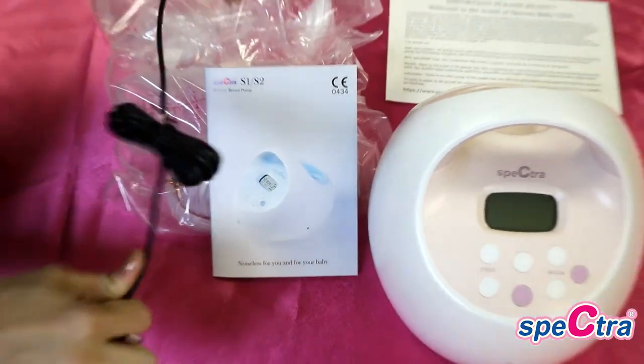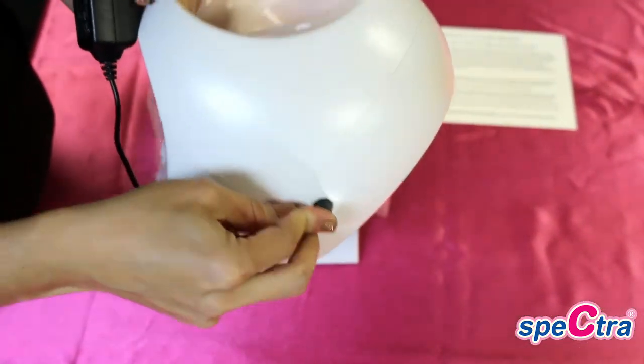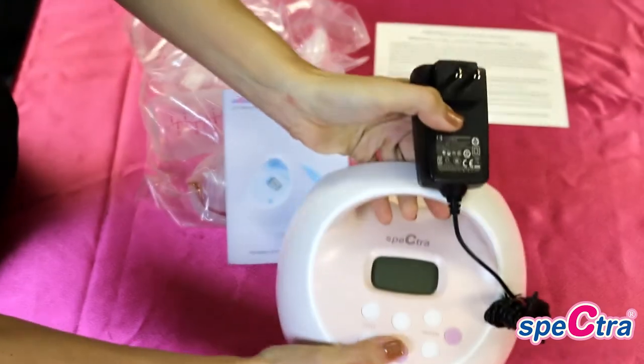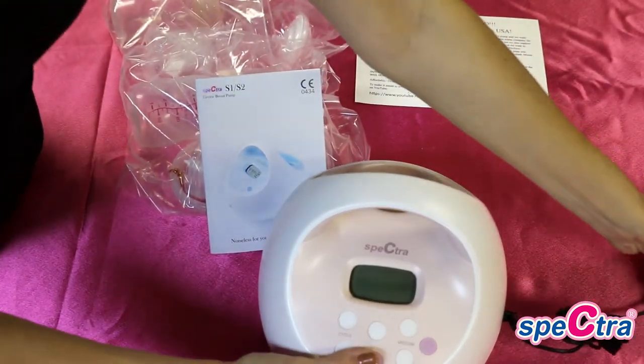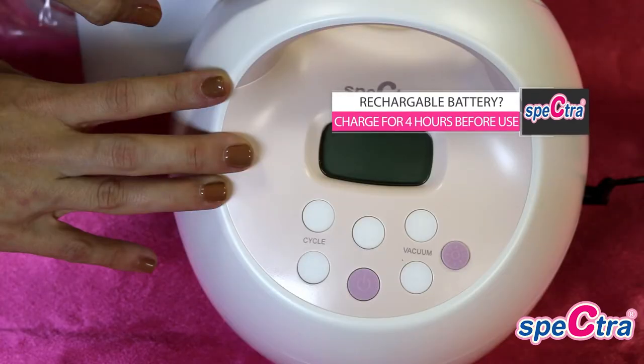You will then want to attach the power cord by pressing firmly until you hear a click. Then you'll plug the pump into a working outlet and press the on button.